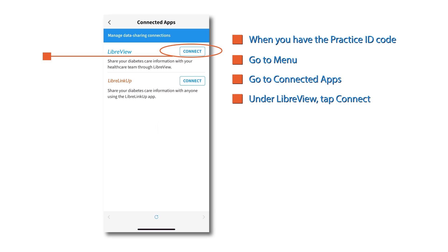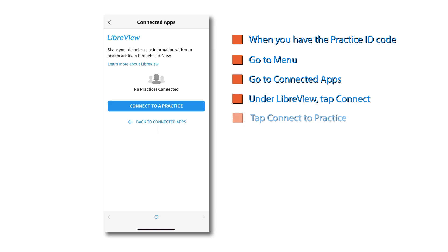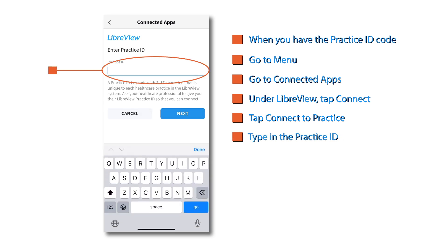Then tap connected apps. Under LibreView, tap connect, then connect to a practice. Type in the practice ID.